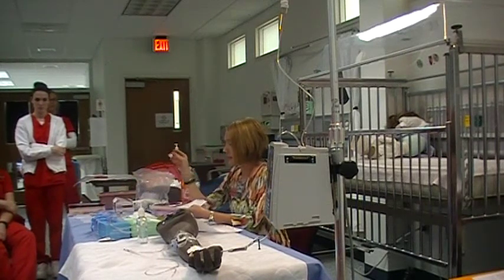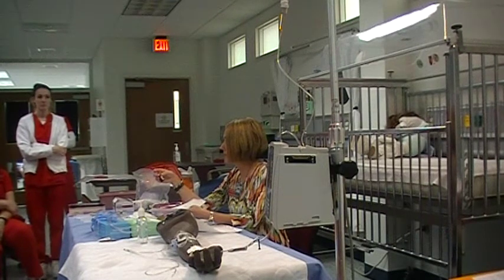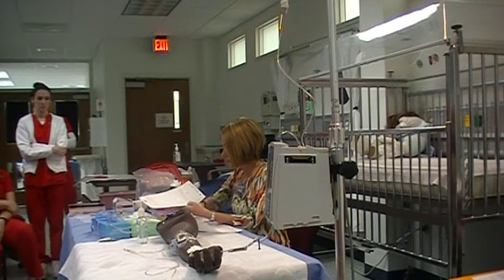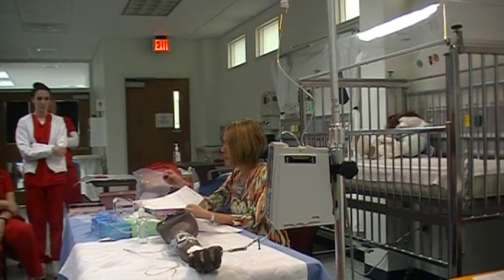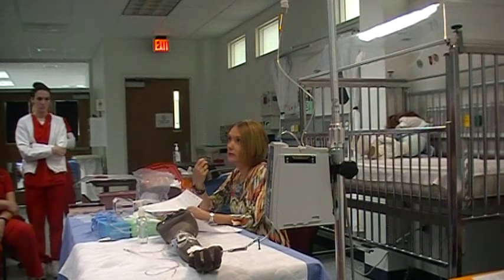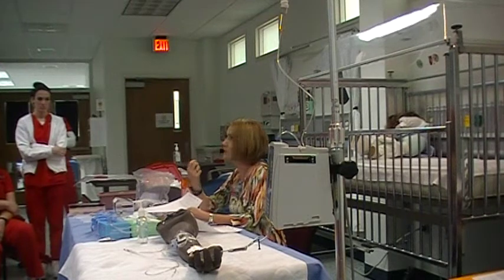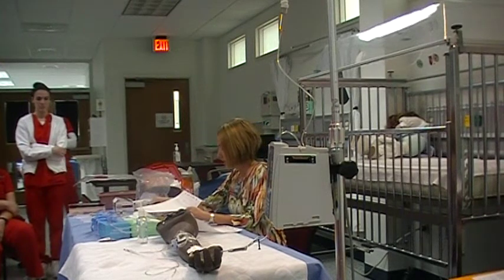So we've got Lasix here on the table, and you're going to say, I have Lasix, and it's 40 milligrams. And you're going to tell me that. So you're going to say, okay, and the expiration date. And most all of them are going to be expired. And you'll tell me it expired in 2012. That's okay, we're going to pretend it's 2014, okay?